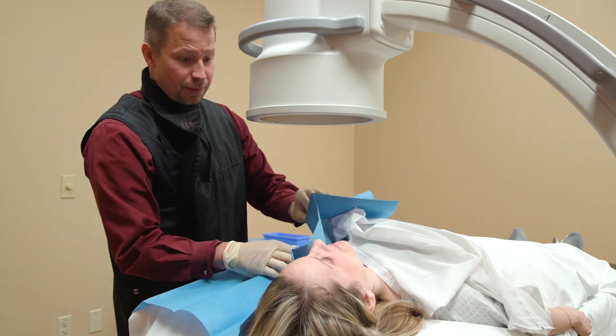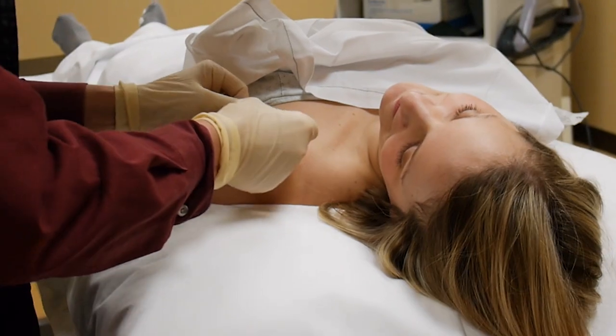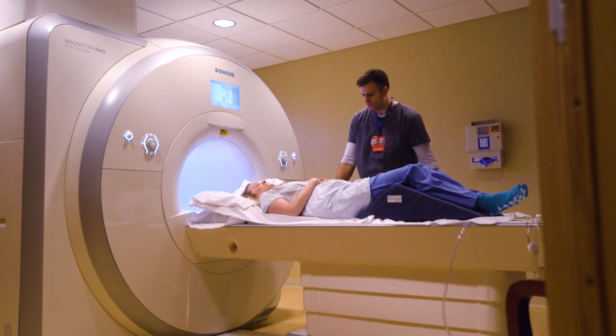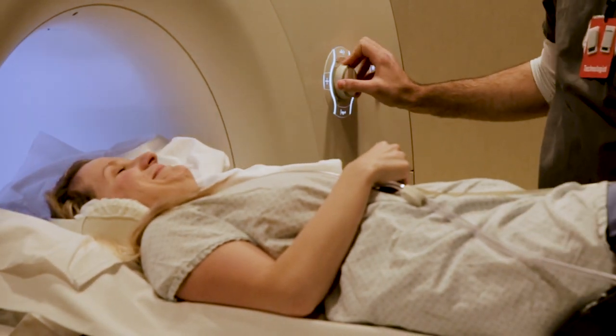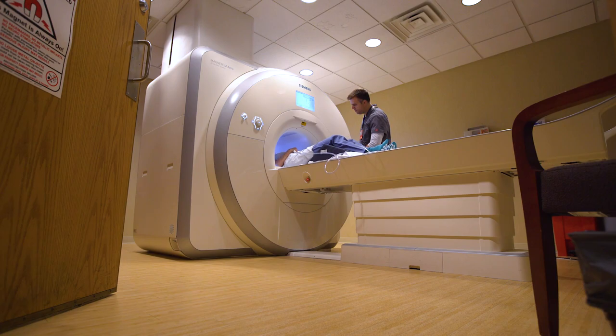Once we're done, the needle comes out, skin gets cleaned, band-aid on, and then they go get their imaging done. We like to do the imaging right after the procedure. We don't want to wait 20 or 30 minutes because the fluid will start to resorb. The body takes care of that fluid, gets rid of it, and we need that contrast in there so we scan them immediately.